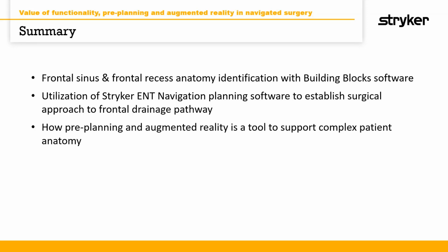And this is important regardless of how you choose to do your surgery, whether you use a balloon or hand instruments or shavers or drills. It's critical for all of us to understand where that drainage pathway is and what cells are narrowing that pathway. And then we can choose a variety of surgical instruments to enlarge that pathway and treat complex patient anatomy that we encounter really almost on a daily basis in otolaryngology.